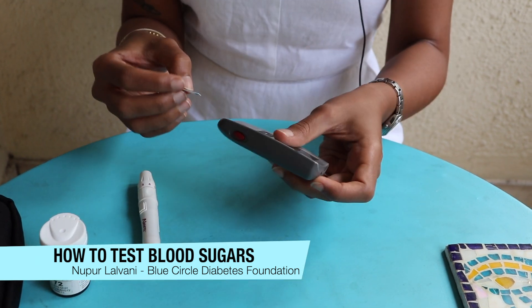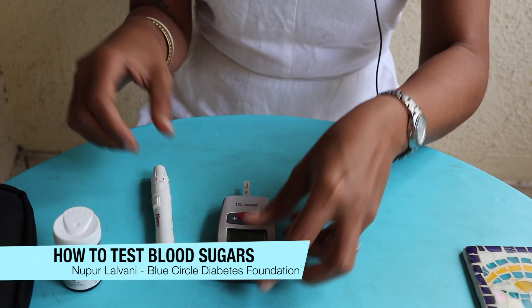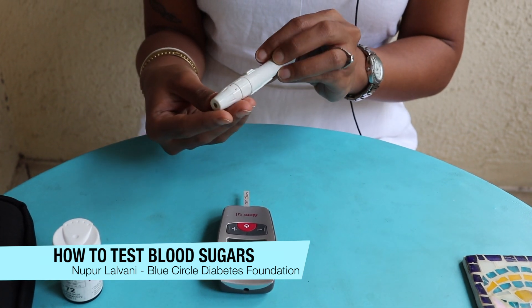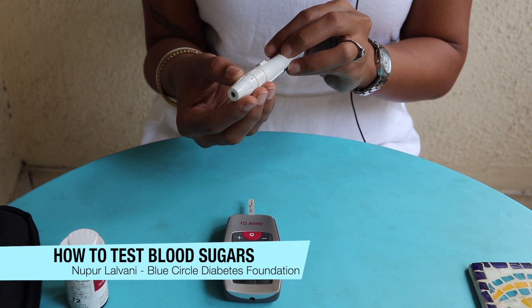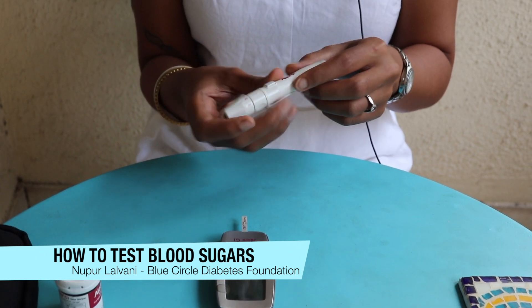Pick up a test strip and insert it into the glucometer. Most lancing devices have numbers here to indicate the level to which the needle pokes you in your finger.